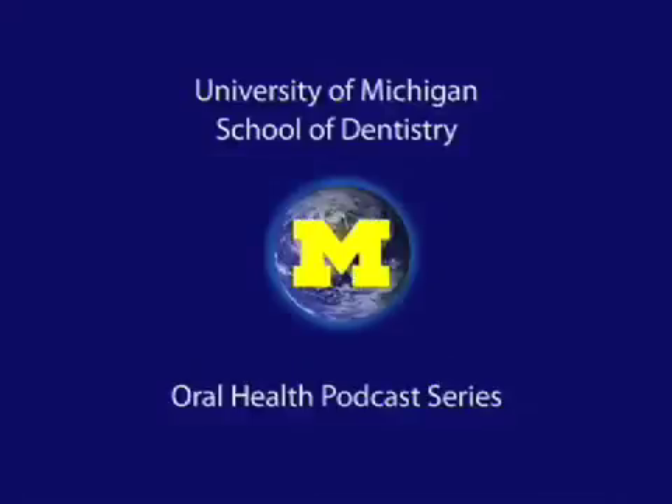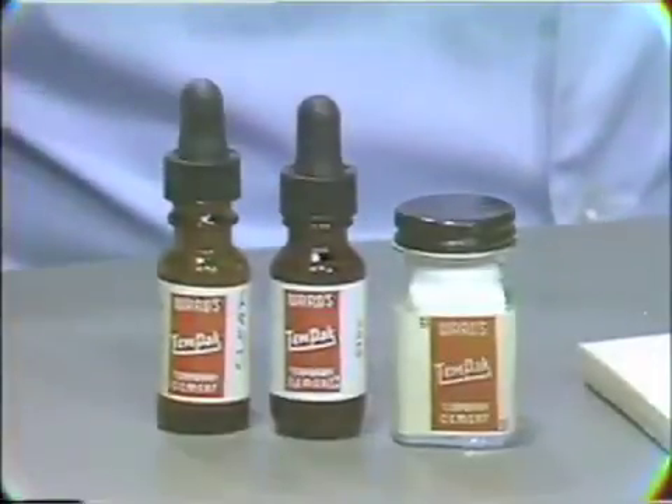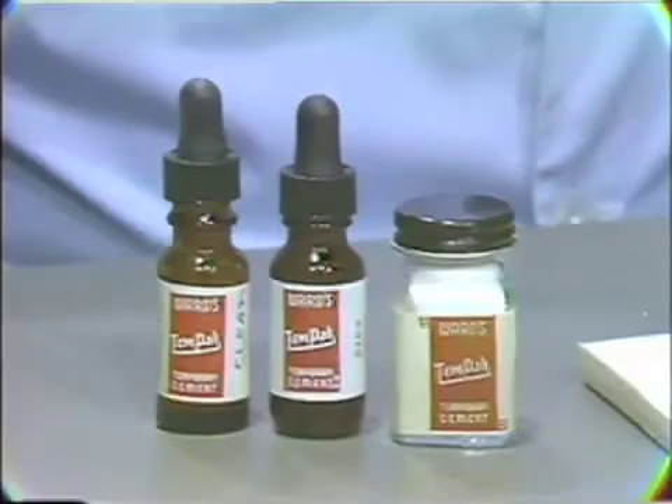Welcome to the University of Michigan Dentistry Podcast Series, promoting oral health care worldwide. We would like to demonstrate for you now the mixing of a very low-strength zinc oxide eugenol temporary cementing material. The material we would like to mix is sold under the trade name of Ward's Tempak Cement.